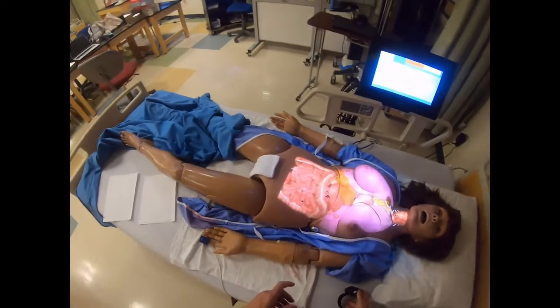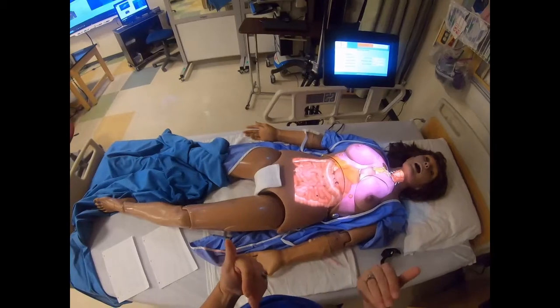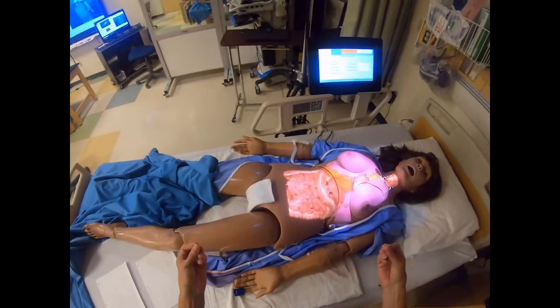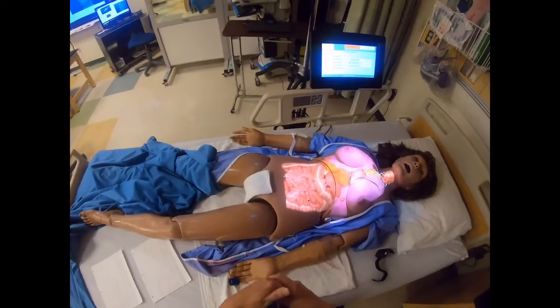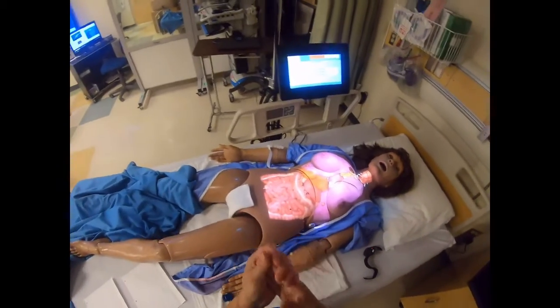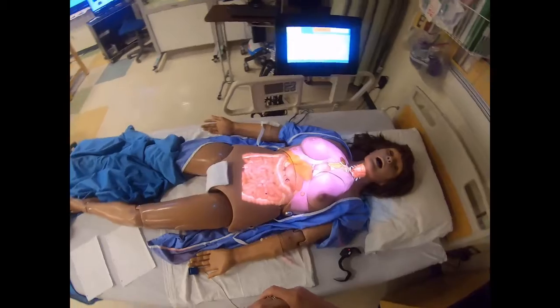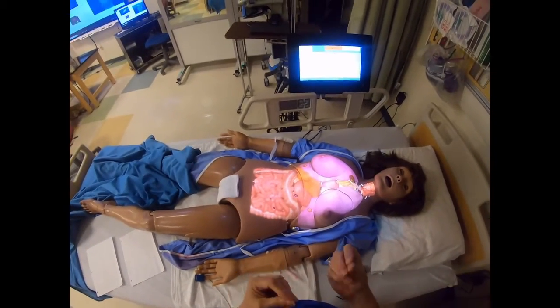The reason that red and purple nail polish cause a problem is that the sensor is looking at the hemoglobin. Hemoglobin is red and it picks up the color. It doesn't differentiate that it is nail polish on your person's finger versus the fact that the hemoglobin is not saturated fully.